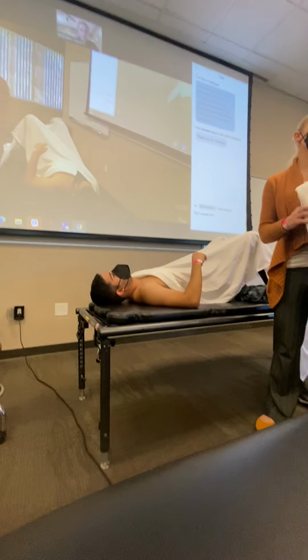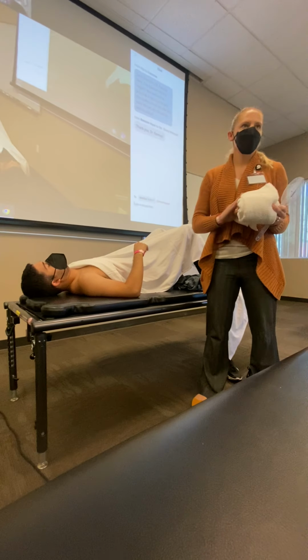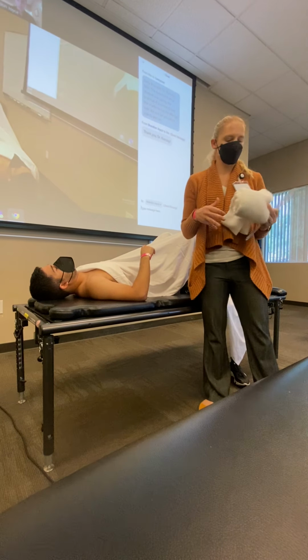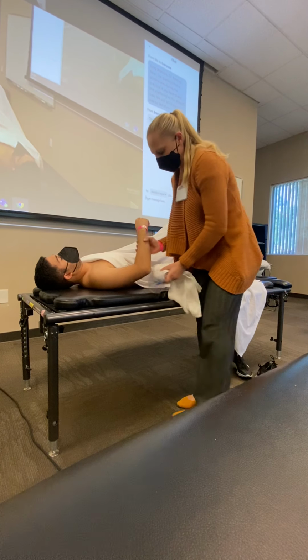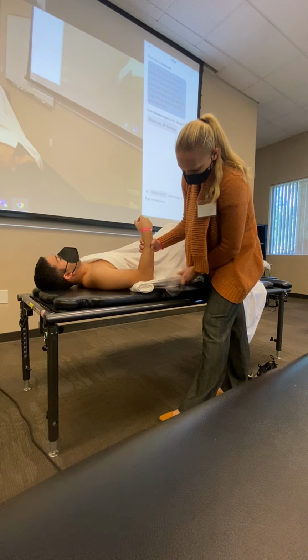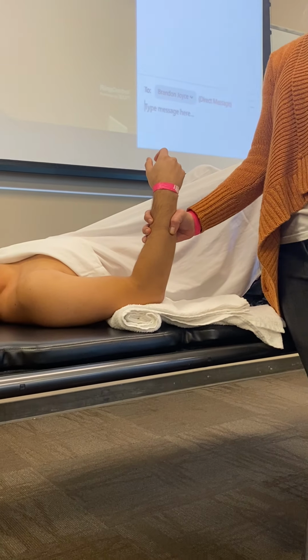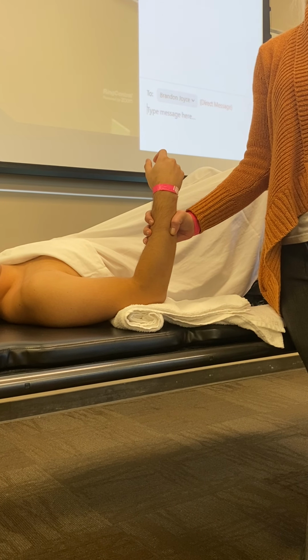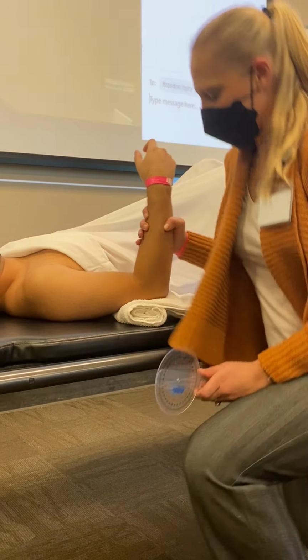So elbow flexion extension, very easy. Patient's going to be supine. Still want them draped and exposed, or only exposing the area that you're testing. I'm going to put a half towel roll underneath the elbow, just so that his humerus is in line with the thorax. He's not in any shoulder extension. So my normal expected range of motion is 0 degrees of extension, 150 degrees of flexion.